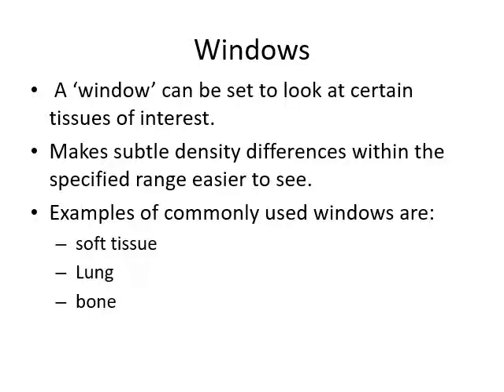And again, this is why I was saying the difference between the imaging in an ultrasound and the imaging on a CAT scan is that the technologist, once they've set the buttons, the machine does all the work, whereas an ultrasound technician has to be really, really well trained to get a really good image. Of course, the CT or the MRI technologist has to know how to put the correct buttons on.